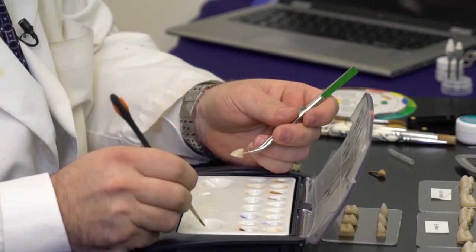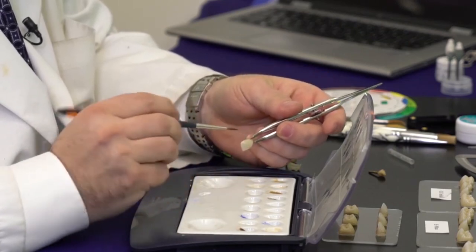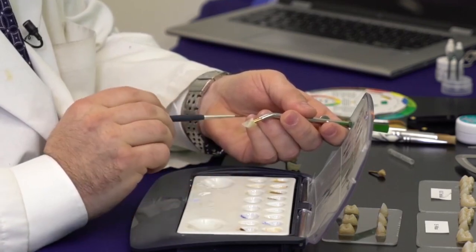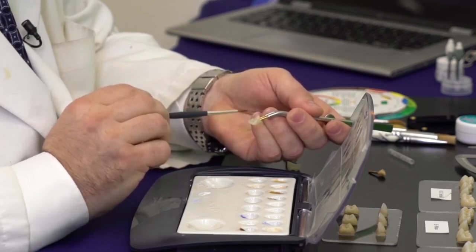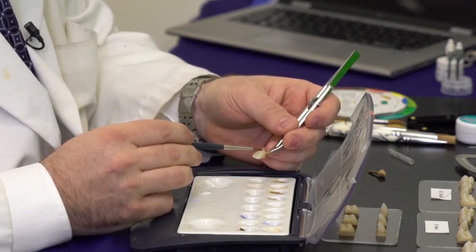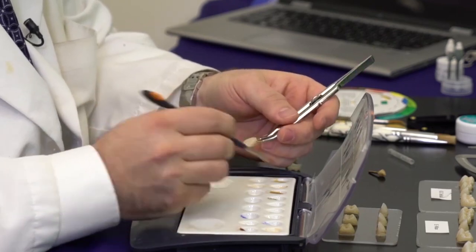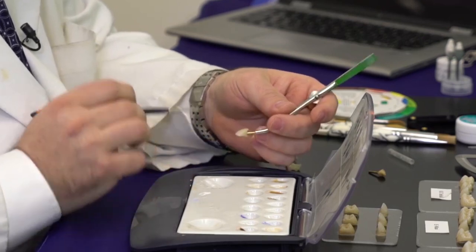I go ahead and increase that chroma as needed into the interproximals as well as into the cingulum — on the lingual rather. On the lingual I extend it a little bit further towards the incisal edge, because typically that's the area where there's a lot of biting forces, more dentin is present there, and therefore it's a little darker or richer in chroma. By the cervical it's significantly more chromatic, and as I go towards the incisal it tends to tone down.